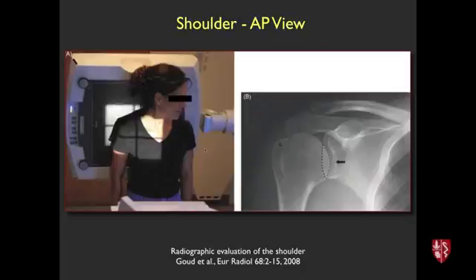A radiographic exam might be something like this, and some of you may have had this done if you had an injury or pain somewhere. In this example, this is a digital detector here, and the patient's positioned with a visible light where the X-ray beam is going to go in the same place, so you can position without radiating the patient other than with light, and then shoot the X-ray. It goes to the detector and then to a computer, and you generate a picture that might look like this, where you're looking at the shoulder, humerus, scapula, clavicle, acromion here.